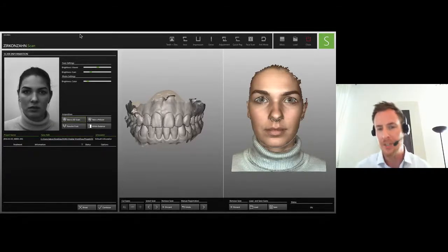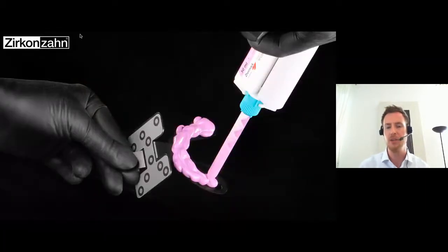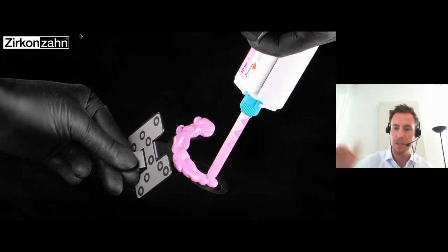We don't match it over the teeth or over the gum. That wouldn't be accurate enough. We use a special fork called a digital transfer fork. This fork has scan markers on the front, and on the back a kind of plateau where you can squeeze silicone onto it.